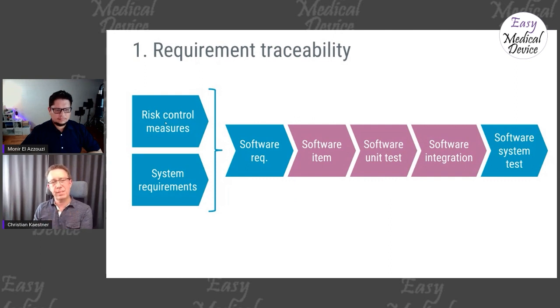Because if you have this established, when you later work with changes and maintenance, if you would like to change the requirement, you can easily see where in the software, where in the source code is this solved? Where do you implement this requirement? And again, it's super valuable to have this well established and not just in different documents. You have to start reading and looking and finding and searching. So really consider again to think about what tools could be used for this. And we will come back more to this.